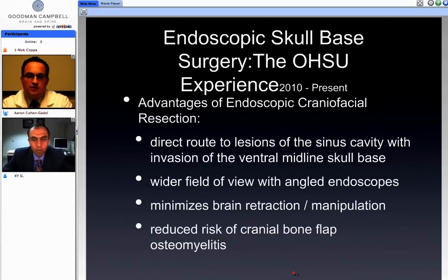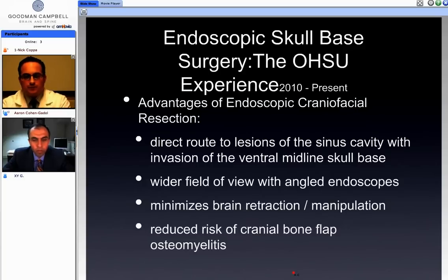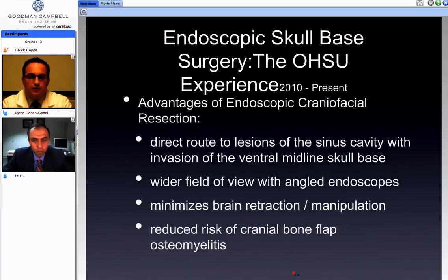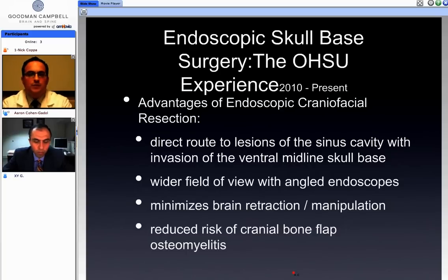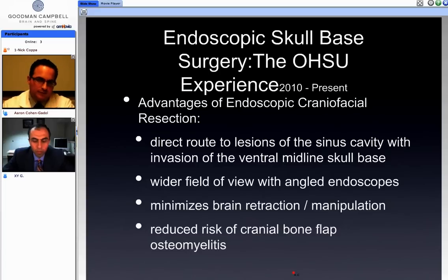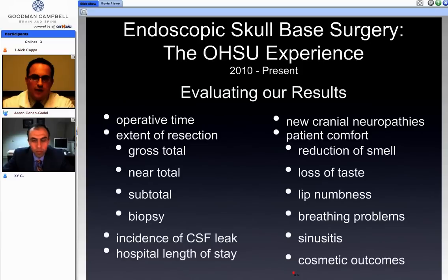What are the advantages of doing it endoscopically? It provides a direct route to the lesion via the sinus cavity. The endoscopes, particularly the angled endoscopes, provide a wider field of view. There's minimal brain retraction and minimal manipulation, and hopefully as a result, minimal neurological morbidity. There's also reduced risk of cranial bone flap osteomyelitis because there's no craniotomy performed, so there's no bone graft that needs to be replaced at the conclusion of the operation.